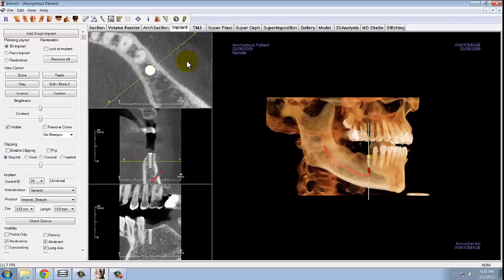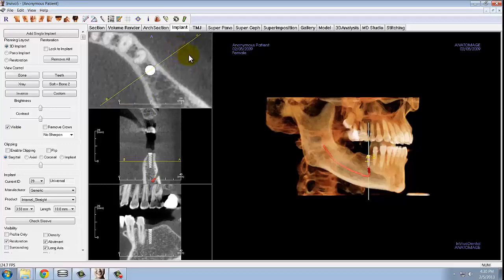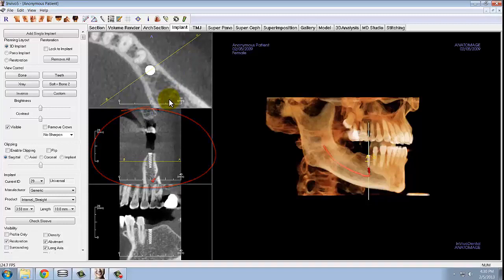Once the implant is situated at the crest, take the AB line and rotate it so that it is perpendicular to the arch. This AB line gives us the plane for the cross section shown in the box below. Having this line perpendicular to the arch gives us the most accurate view of the amount of bone we have. Forgetting to rotate this line so it is perpendicular to the crest is a common mistake, but this is crucial for visualizing the bone that you have.